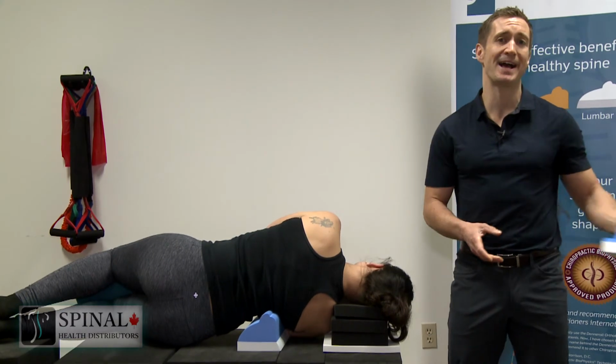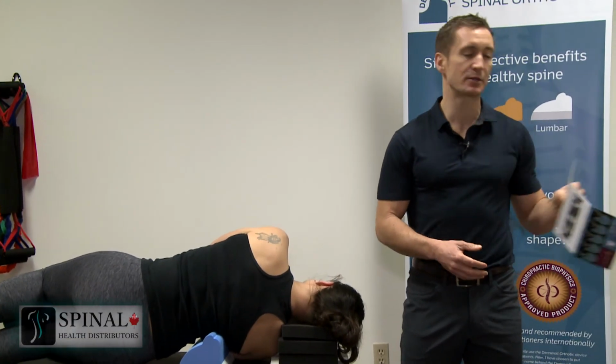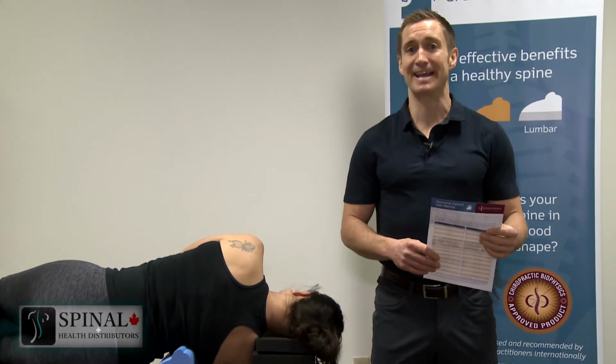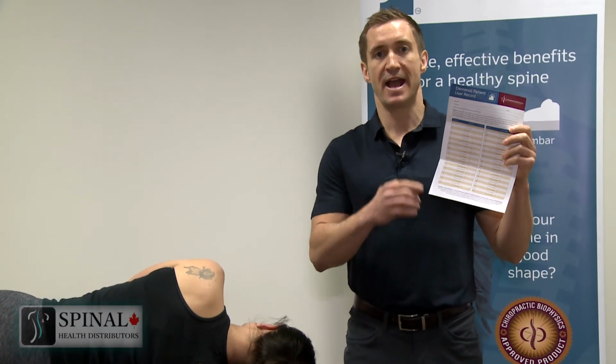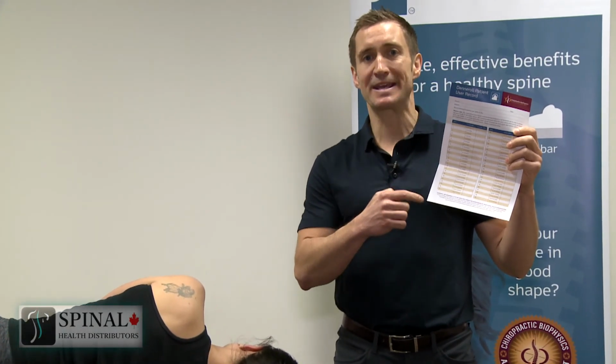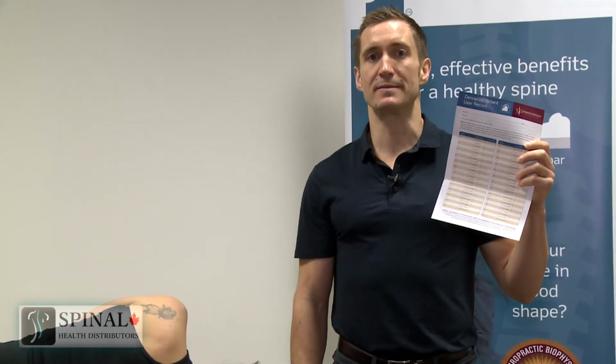Every single unit has a time card. We want the patient to build up to 20 minutes daily. Every single Scoliroll comes with a time card just like this, and it gives a time progression so that we can get the patient built up to 20 minutes every single day.